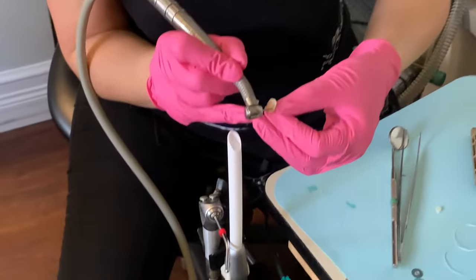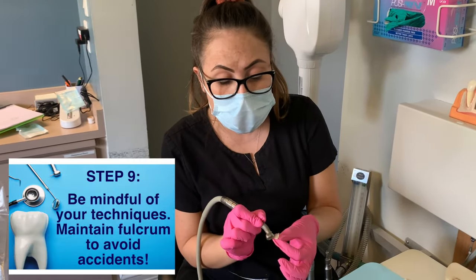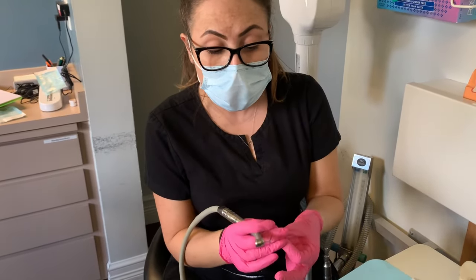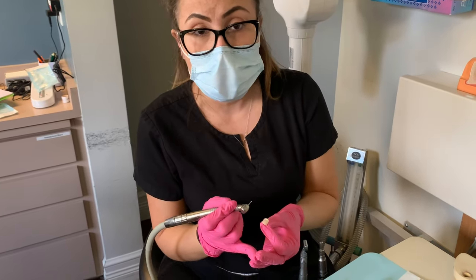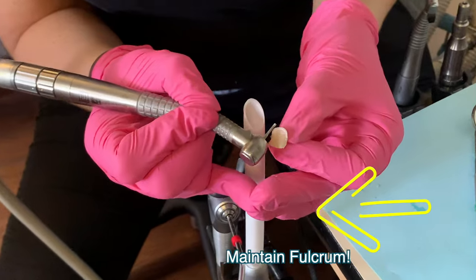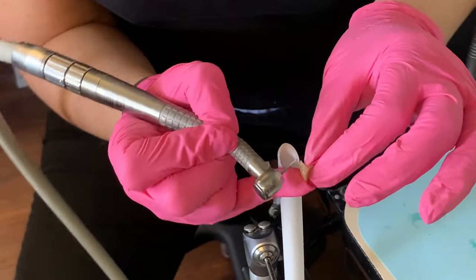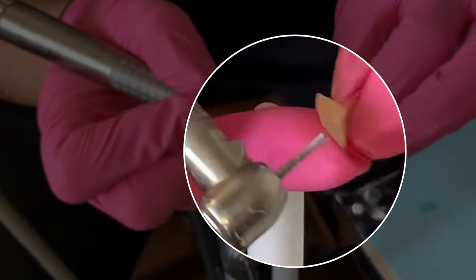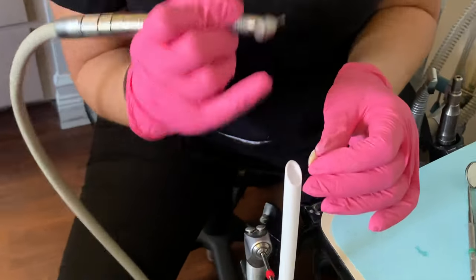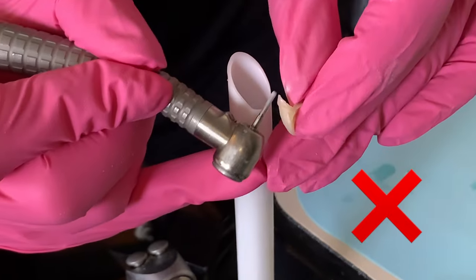I start just removing all the extra stuff first. You want to make sure that you have your fulcrum — you don't want to just go freely because you're going to trim things you don't want to trim. Grab the temporary in one hand; the other hand, pull from here and you have more control. I'm going to remove from the margin first. Be very careful on the contact — you see all this extra stuff, you're going to want to remove it, but then you create an open contact. You can't do that. You want to make sure that you only polish, and then later you can modify that. Very carefully, just go like this on the facial part.